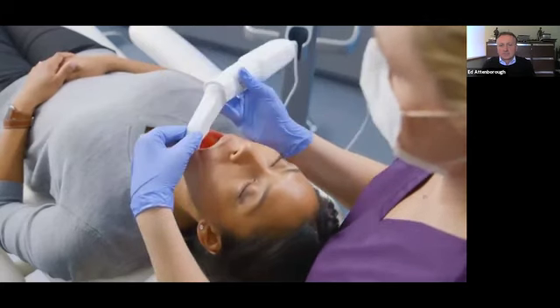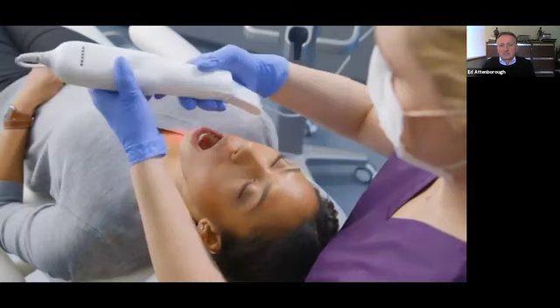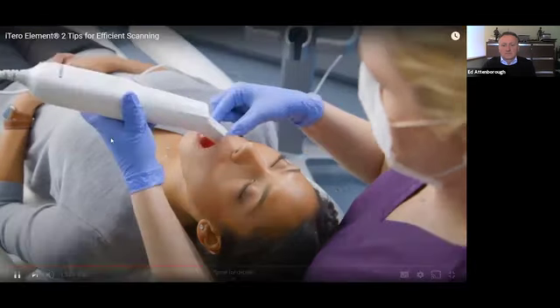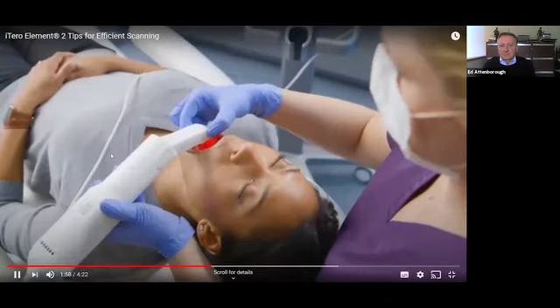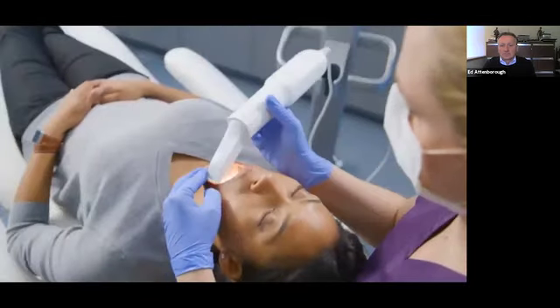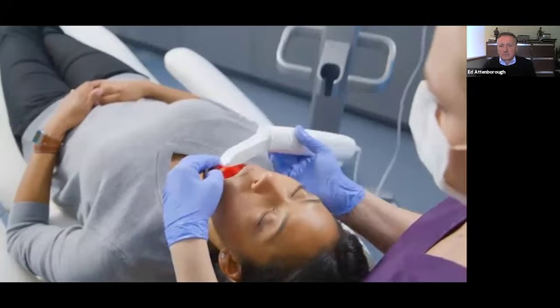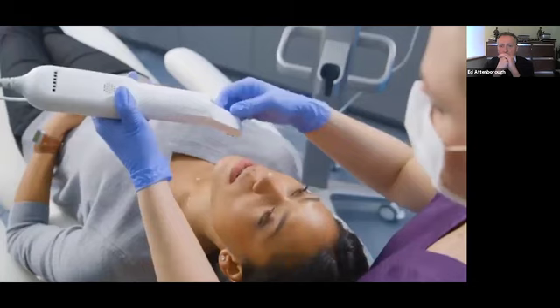At the midline, I will remove the wand from the patient's mouth, place it on the occlusal of the contralateral terminal tooth, roll to the buccal, and follow the arch around to the midline. I use a rocking motion while scanning the buccal and a rolling motion while scanning the lingual to capture the interproximal surfaces, pointing the tip of the wand toward the anatomy I'm intending to capture.